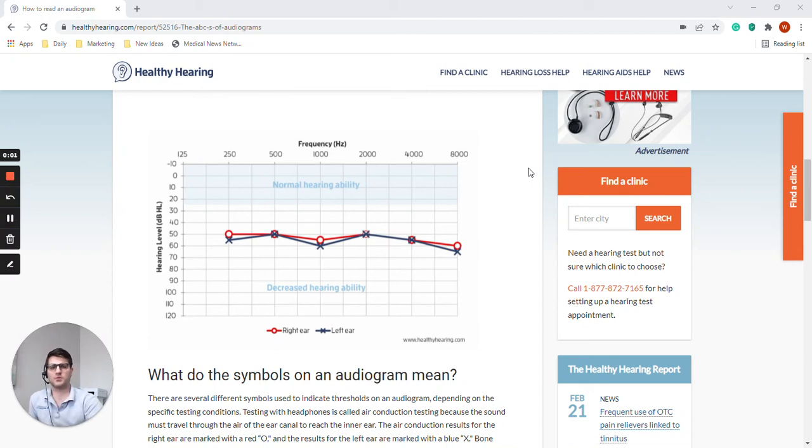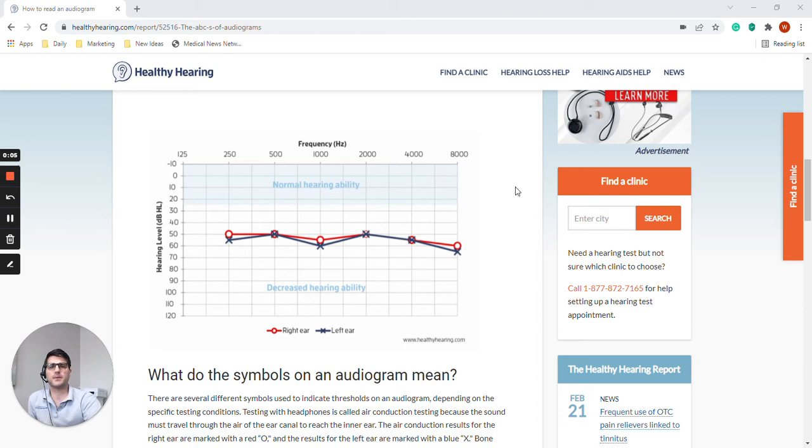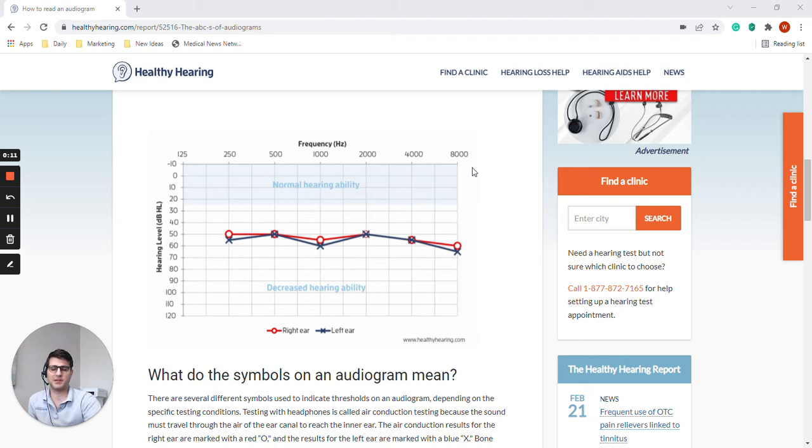Hello everyone, my name is Walter and I'm from Comprehensive Hearing Solutions and today we're going to talk about audiograms. So this graph here is an audiogram. It's a graph that plots results of certain hearing tests.